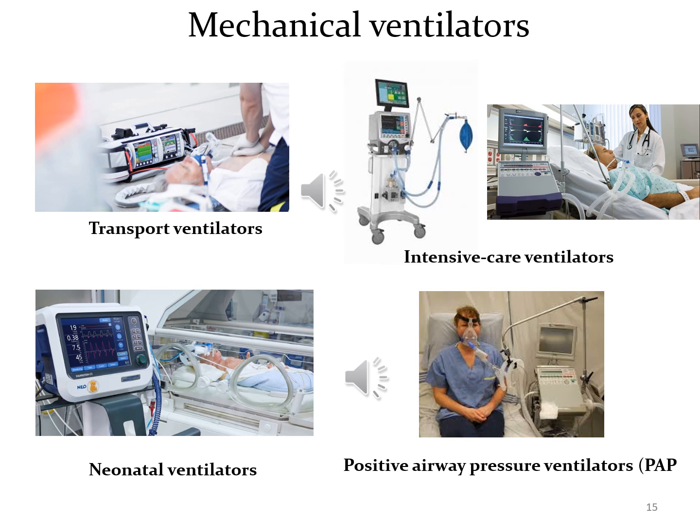Mechanical ventilators. Transport ventilators. These ventilators are small and more rugged and can be powered via AC or DC power sources. Intensive care ventilators. These ventilators are larger and usually run on AC power.